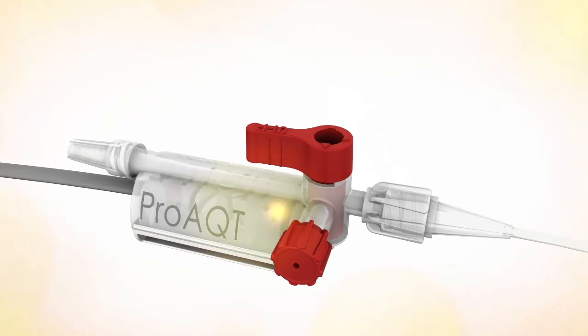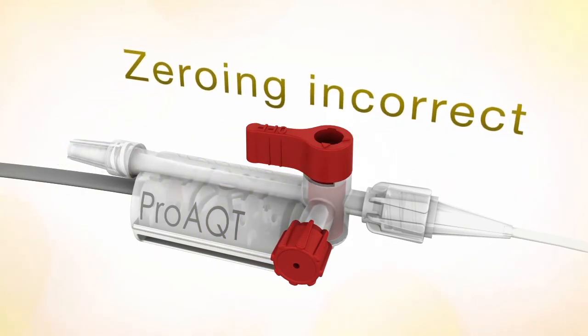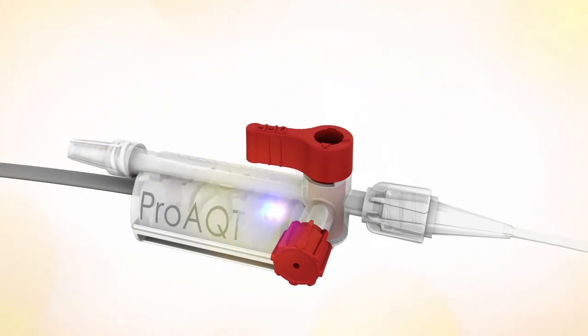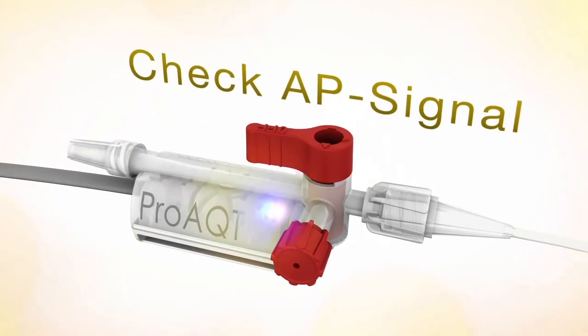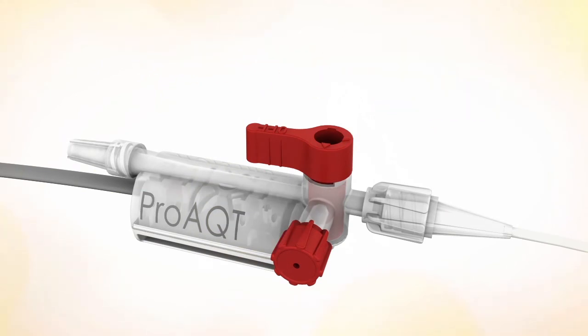Three short orange flashes indicate that zeroing was incorrect. Continuous flashing of blue and orange light at the same time means the AP signal needs to be checked. Three repeating short orange flashes indicate sensor failure. Thank you.